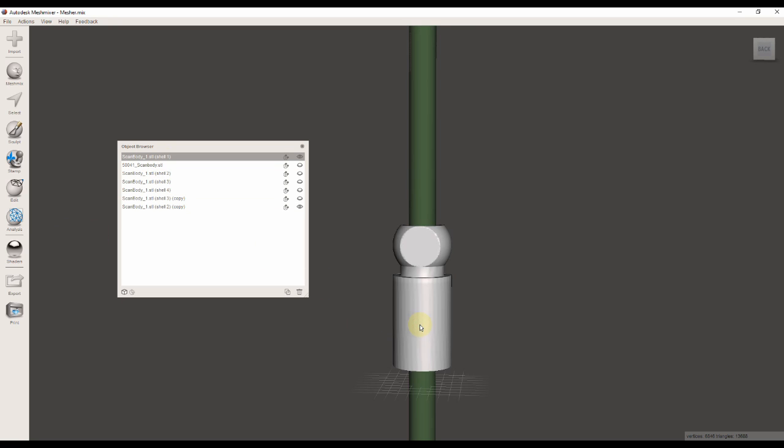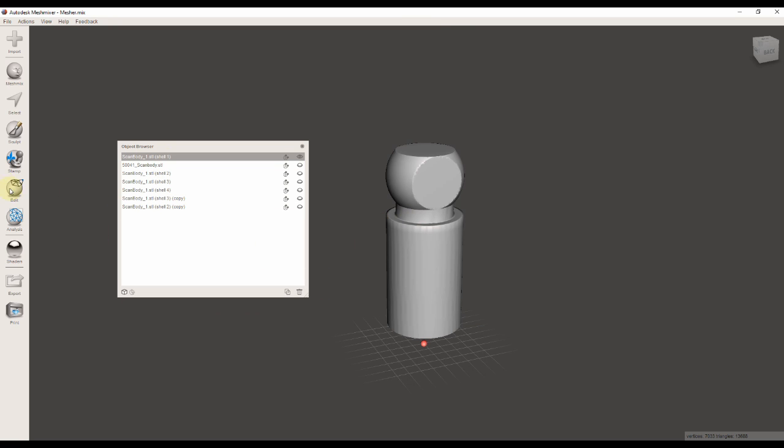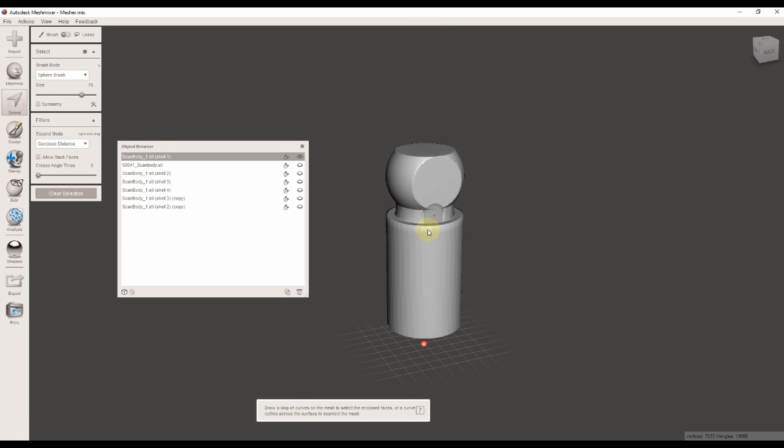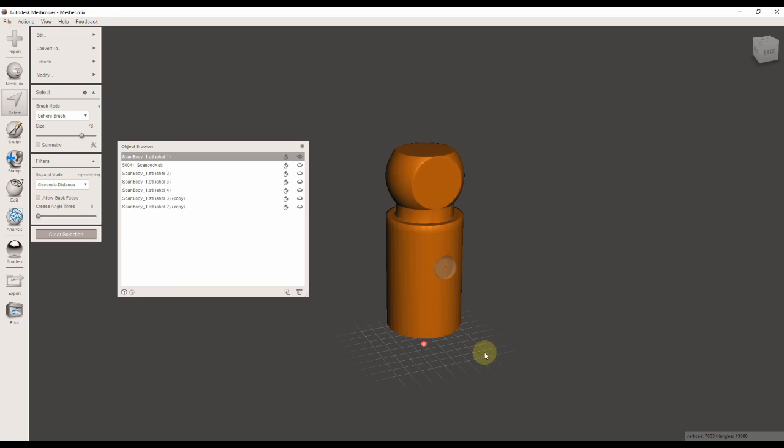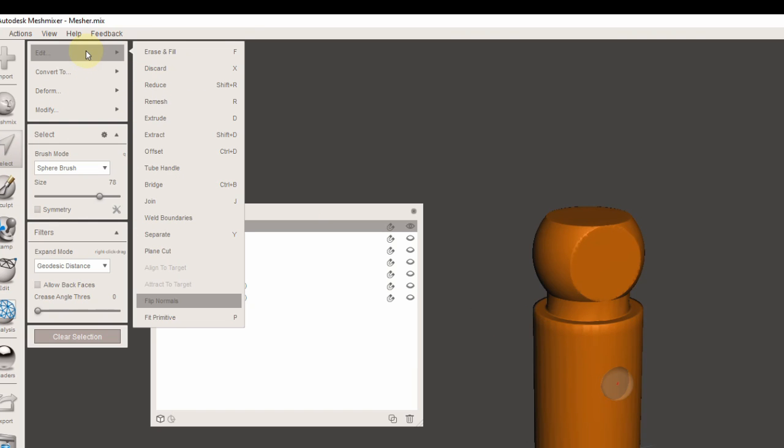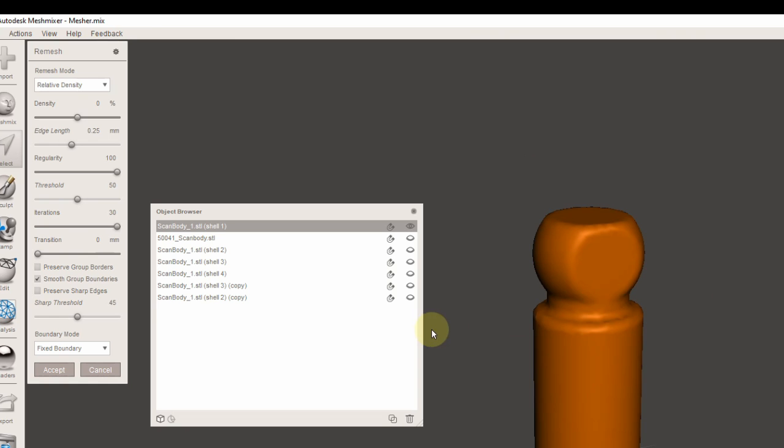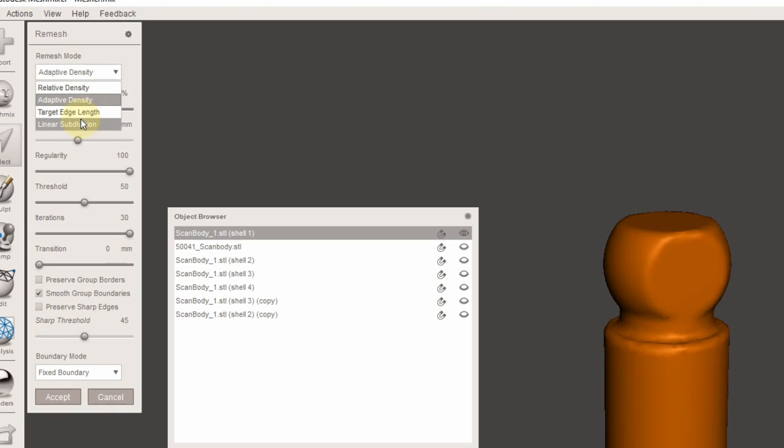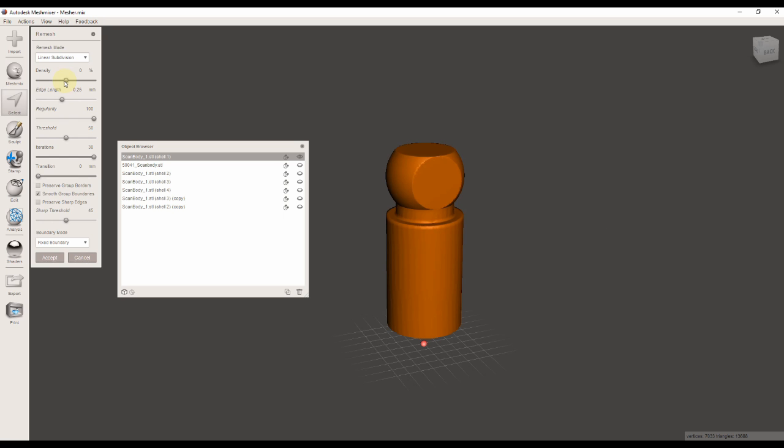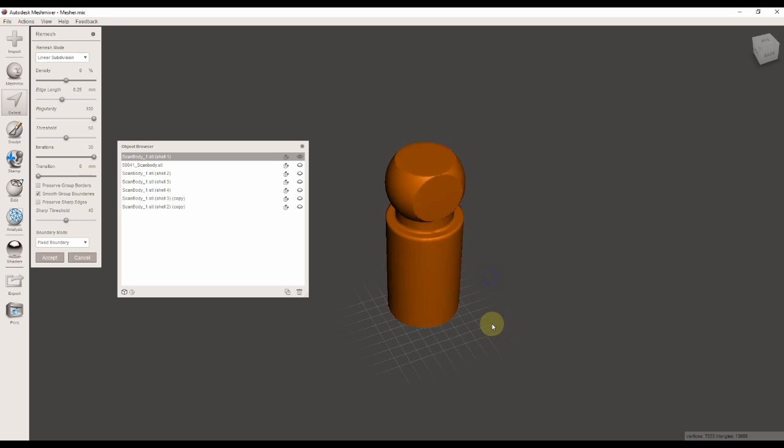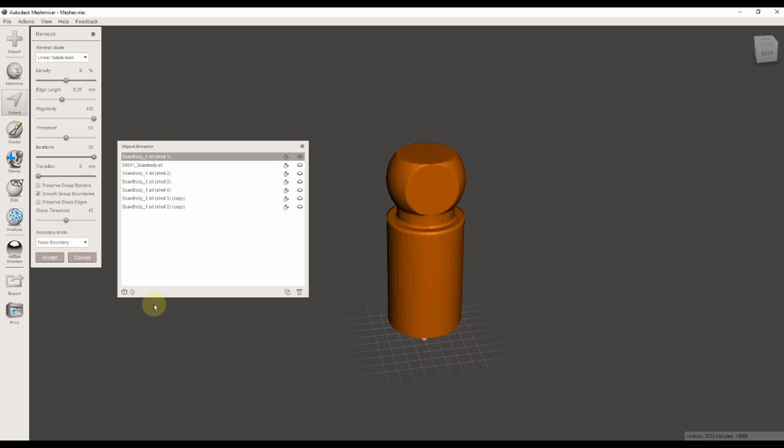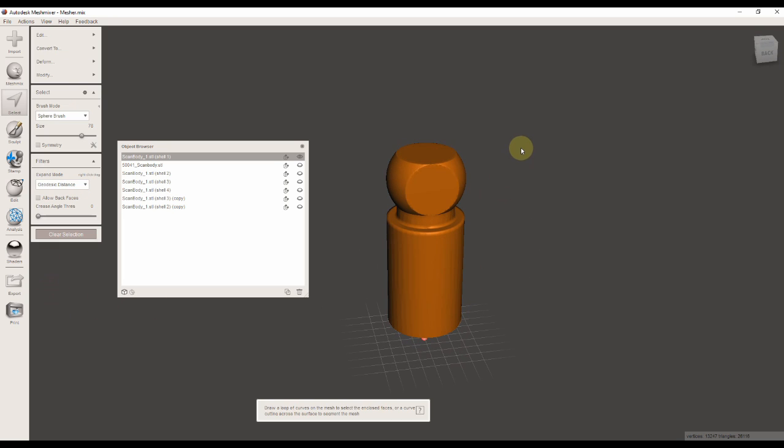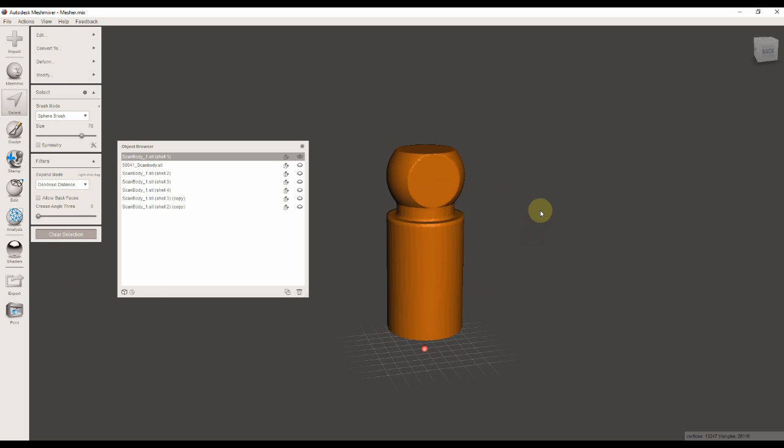One important step is to remesh the scan flag. Therefore, I'm going to select it by double-clicking on it and clicking on Remesh. I'm going to select Linear from the Remesh Mode. The remesh mode is really important because we want to avoid errors when we cut a hole through the scan flag with the screw channel STL.